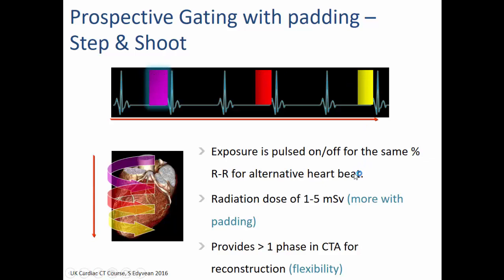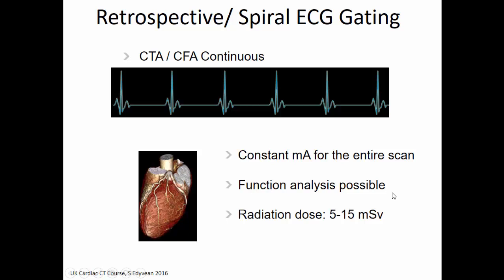And that just provides the flexibility when you have your real ECGs, you know, not this superbly perfect thing. So that's one approach, and prospective scanning is the least radiation dose.